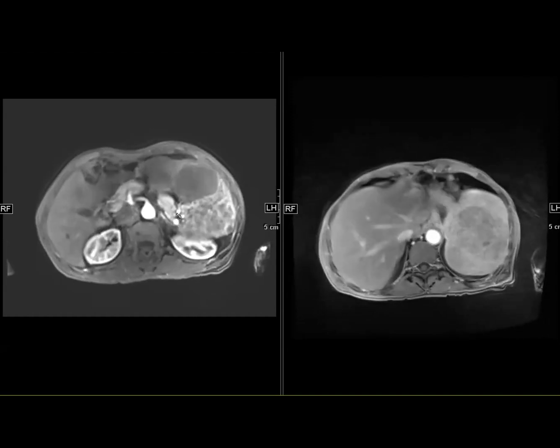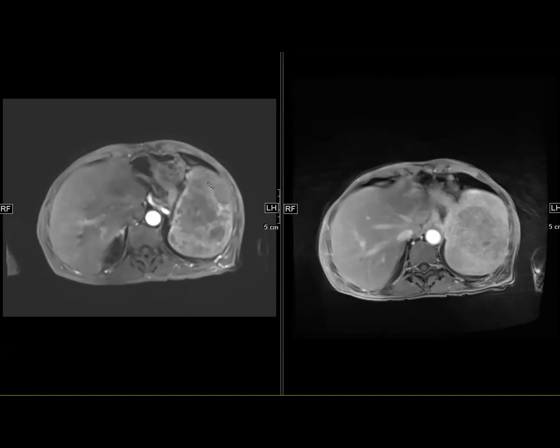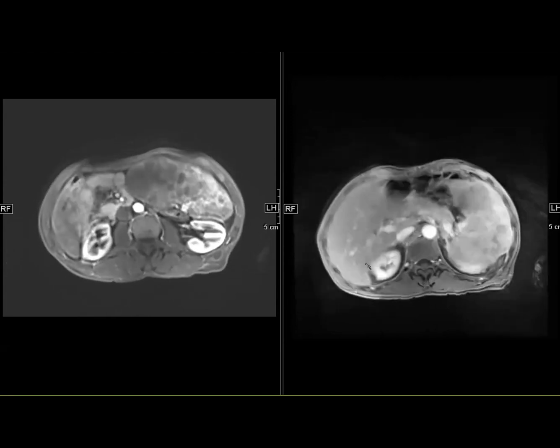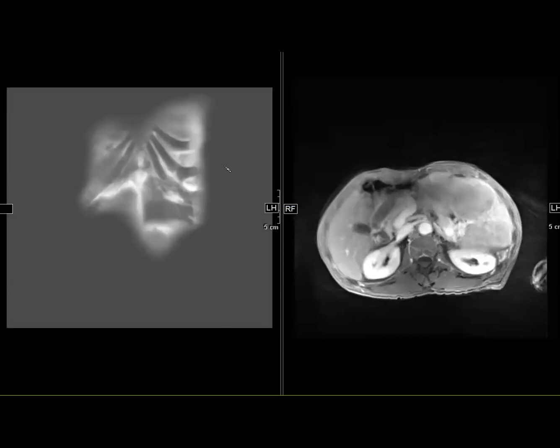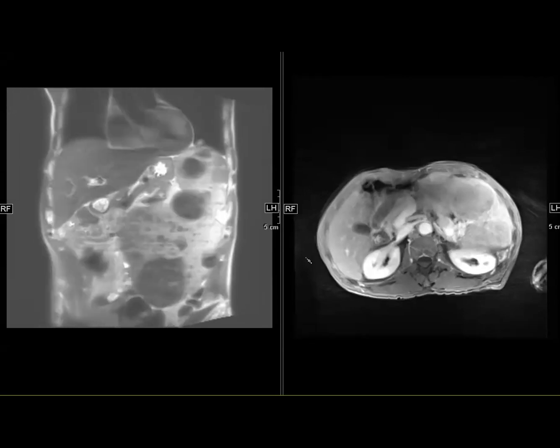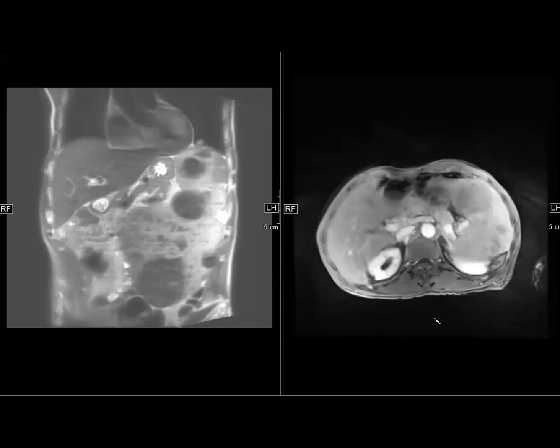Yeah, I had a case too where it was in the spleen, and that's a great thought, especially if you have myelofibrosis and then extramedullary hematopoiesis in the spleen. Great thought. That wasn't what this was. We Googled a lot and found cases of littoral cell angioma that had multiple lesions, T2 dark, delayed enhancement, so maybe this is littoral cell angioma. We found online cases with lots of lesions, even moderately large lesions. So that was our top diagnosis.